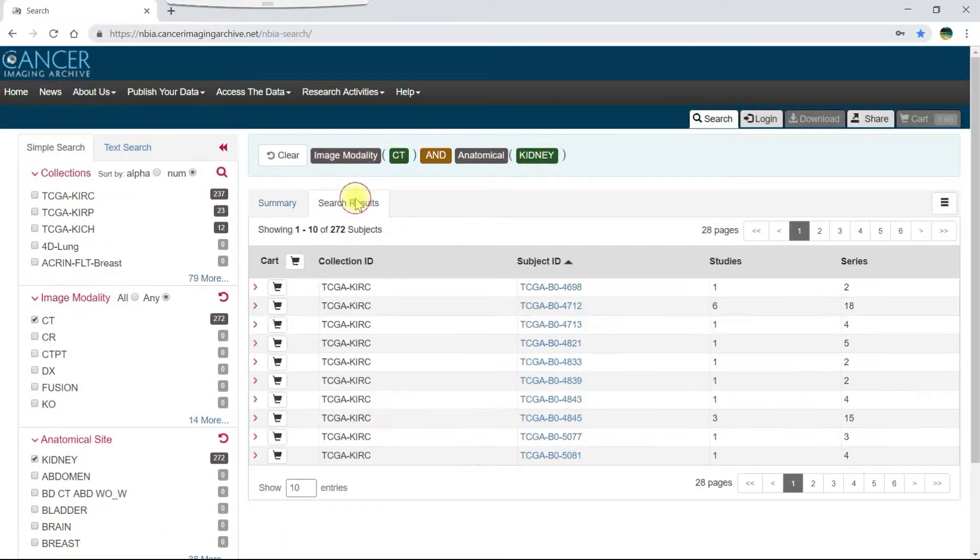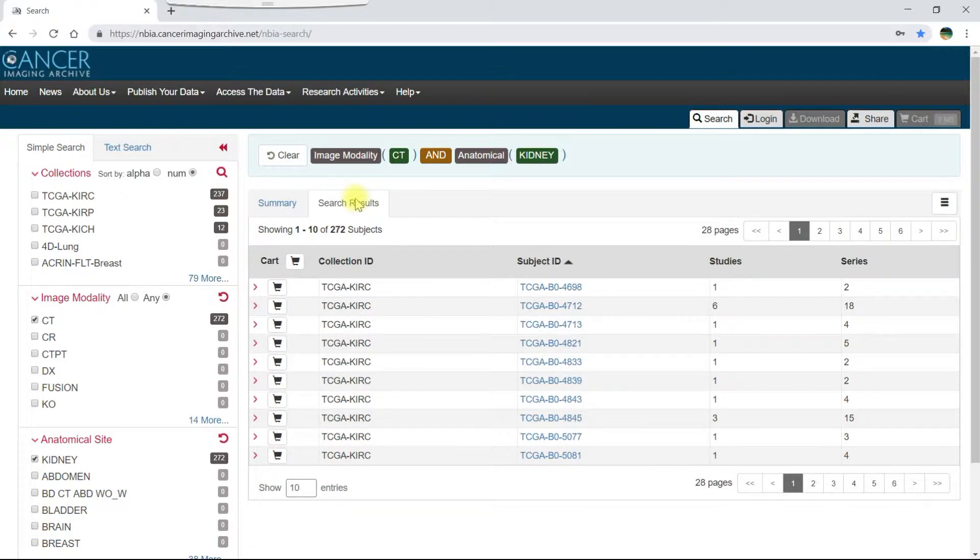Click the search results tab if you are not already on it. The data portal displays search results on either the summary or search results tab first, depending on which tab you last had open.